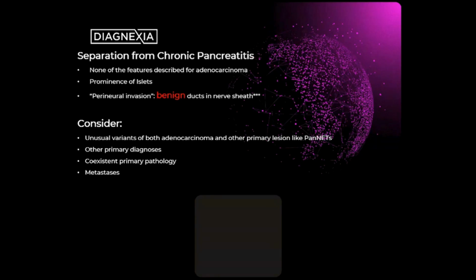In chronic pancreatitis, oftentimes you have prominence of the islets. The reason is you have acinar atrophy and fibrosis, but the islets survive. That's because the acinar tissue is exquisitely sensitive to fibrosis and ischemia, whilst the islets tend to survive more. As a result, they look a lot more prominent. They're more frequent because you've now got fibrosis and rounded aggregates of islets of Langerhans present.